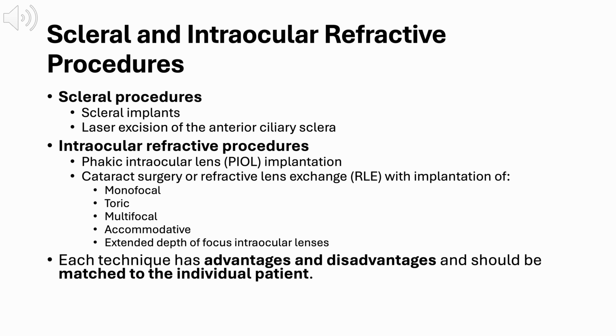The key concept to carry forward is that every technique has distinct advantages and disadvantages, and successful refractive surgery depends on matching the procedure and lens choice to the individual patient, rather than forcing a single solution on everyone.